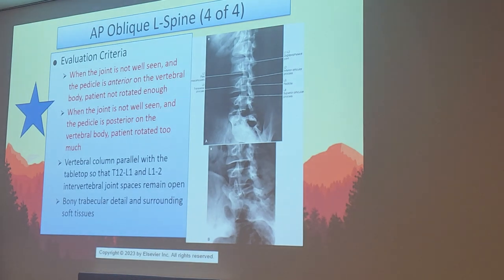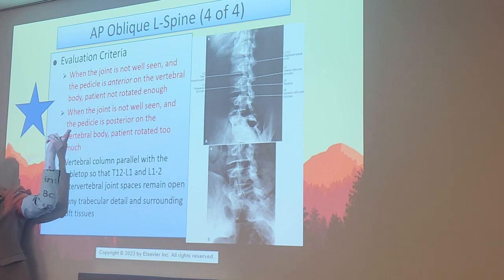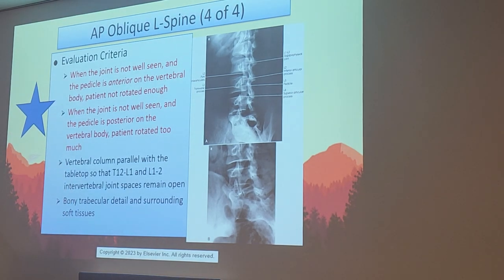Probably not today, but when we get to the actual image critique part that I have for you guys, you'll see what I mean. I'll show you. So basically, please write that down. Put a big star on those two statements. So basically, you're saying if the eye is more anterior, it's under rotated. If it's more posterior, it's over rotated. Correct.